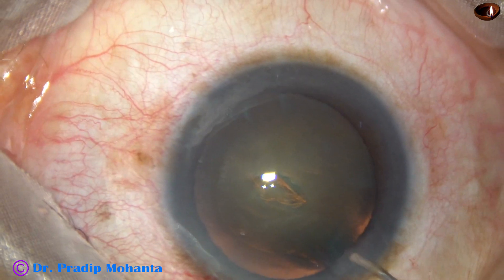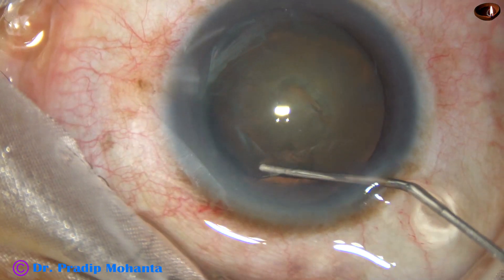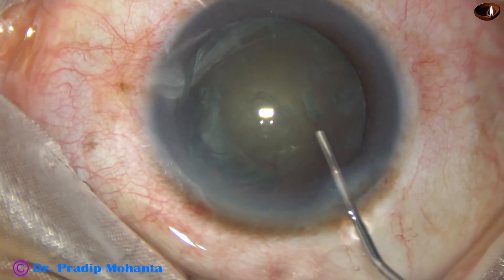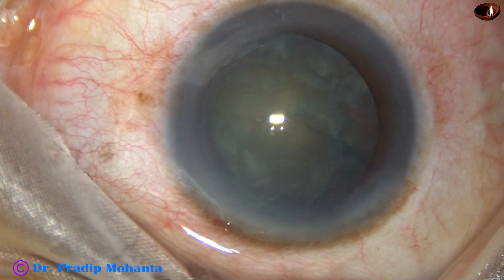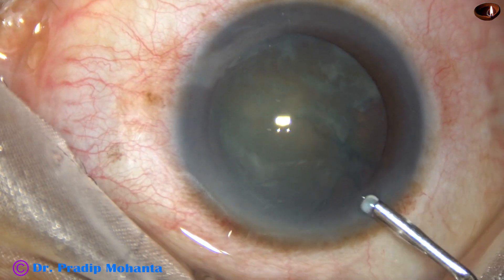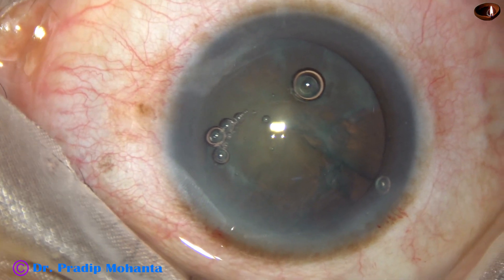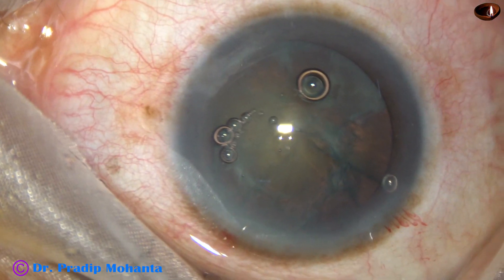Now, hydrodissection is done by BSS and this 27-gauge cannula. The nucleus is mobilized. Visco is again injected into the anterior chamber. An air bubble also has gone into the anterior chamber.